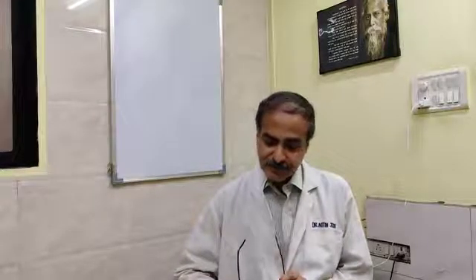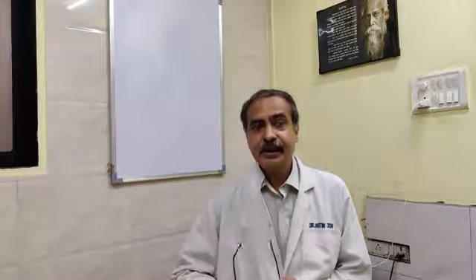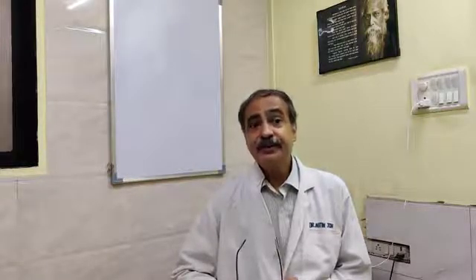Next question, doctor: suppose in a case of diagnosed subtrigonal perforation you are successful in catheterization after rectal support, what will you do? Since there is a subtrigonal perforation, there will be some degree of extravasation. After putting a catheter, the bladder will be drained.